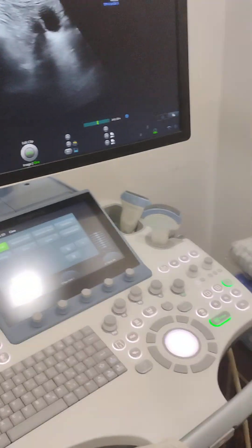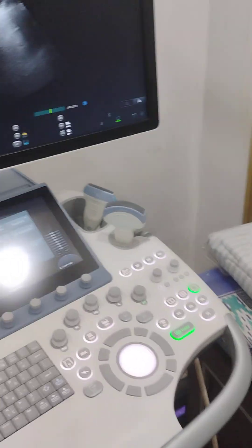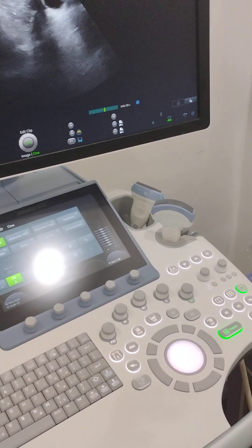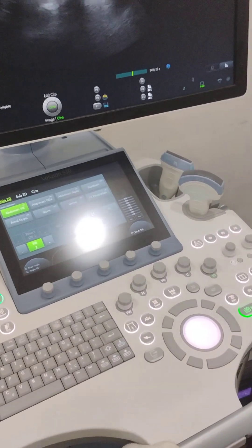In another video I will be telling you about another machine, because this particular doctor has two machines. This is the tour of the first machine. In another video I will be showing you the second machine. Goodbye guys.